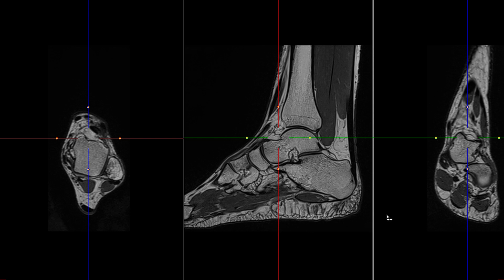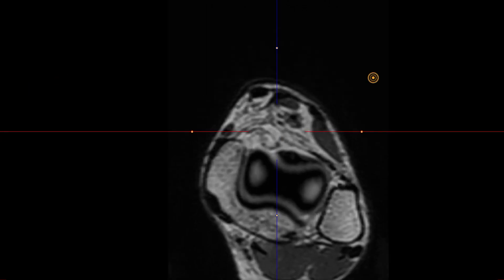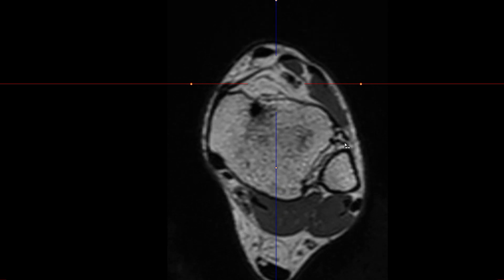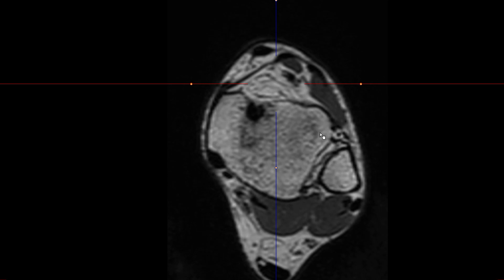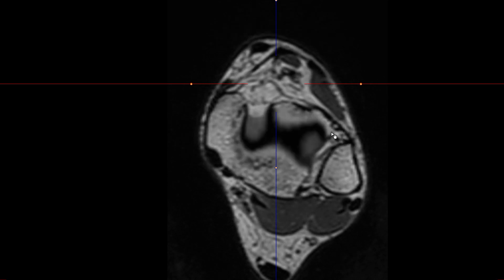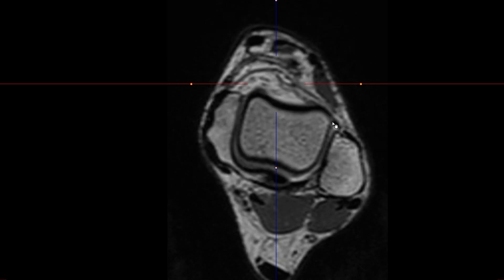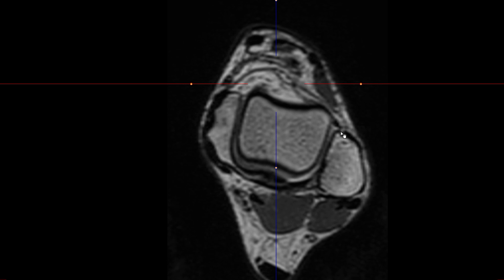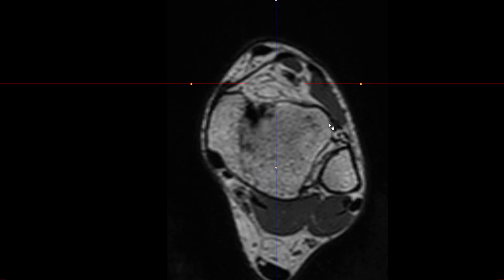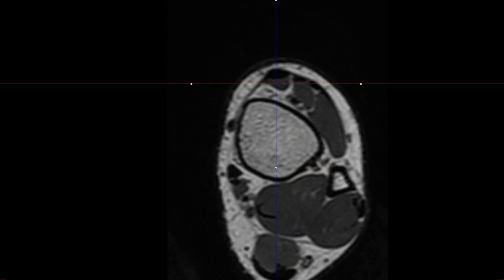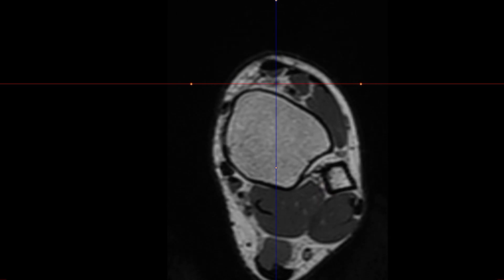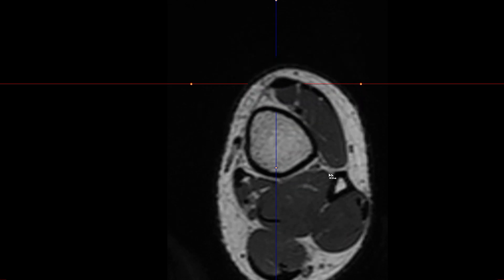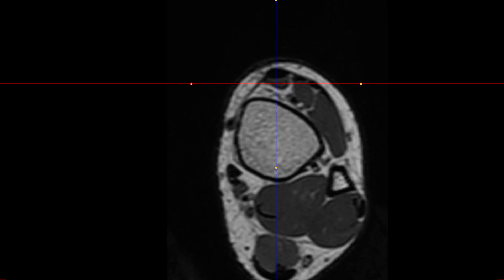This is a very good example showing all the other ligaments. In a transverse section above the ankle joint, with tibia and fibula visible, you can see Chaput's tubercle and the different parts of the anteroinferior tibiofibular ligament — the anterior syndesmosis — with fat in between running downwards. There is also a ligament running a little deeper and more inferiorly than the rest, which is Bassett's ligament. Going higher up, the interosseous ligament has different components, and the interosseous membrane above is very thin — if it looks thick, consider scar tissue from an old injury.